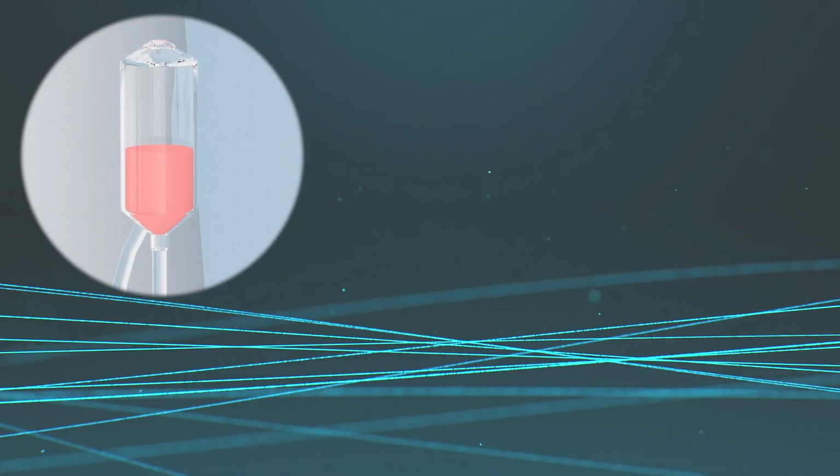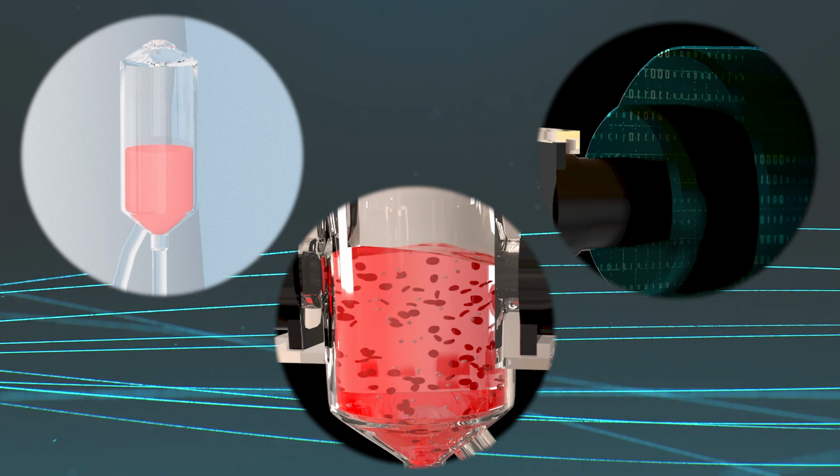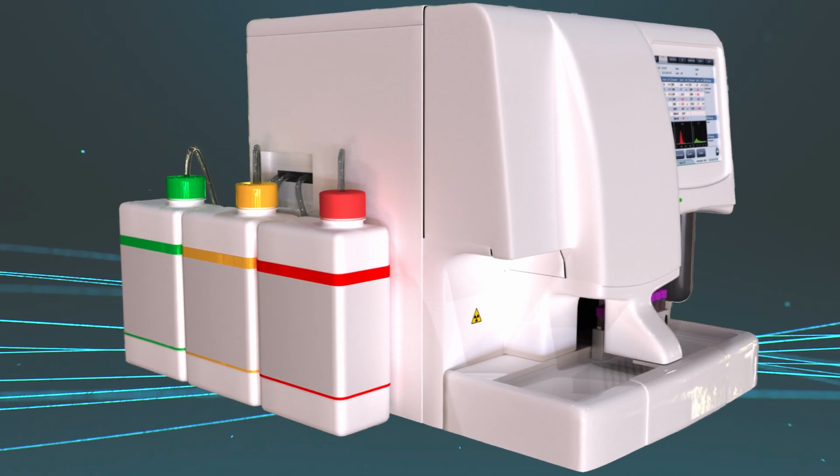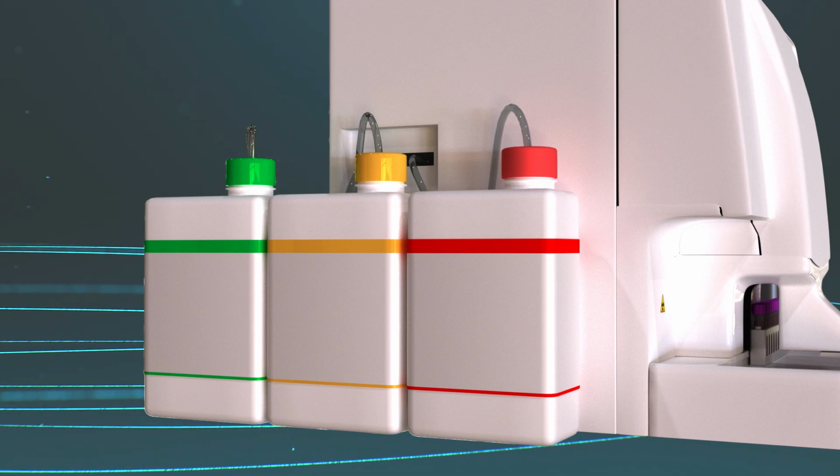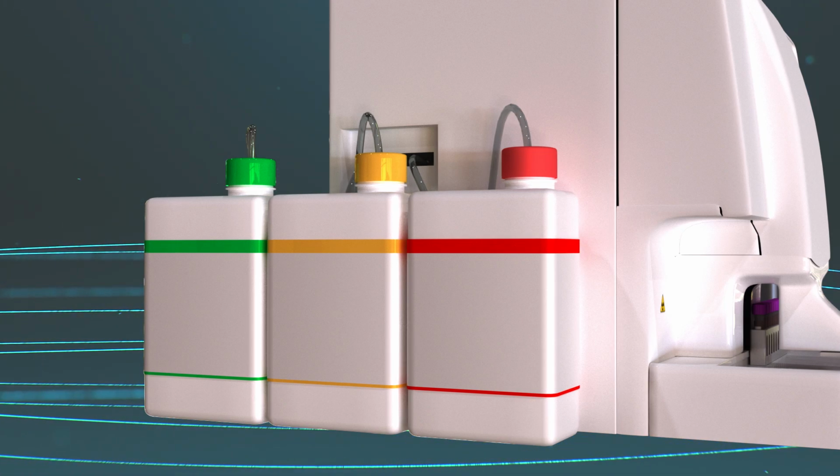Each dilution chamber, reaction chamber, and analyzing component is flushed with diluent once analysis is complete and prior to the next sample being aspirated. This prevents carryover contamination from one sample to the next.